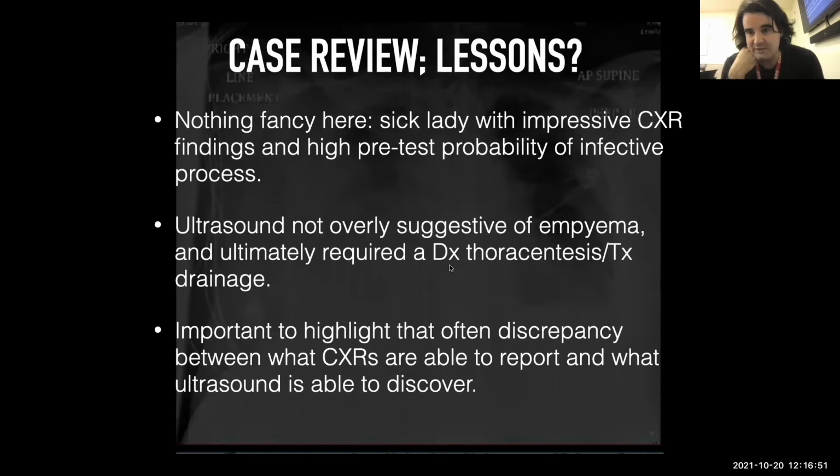But I think I just wanted to highlight a couple of things here: that ultrasounds don't always show you that a pleural effusion would be exudative, okay? And they can be pretty black and simple appearing on ultrasound and CT, okay? But still be infected. And I think that's often a misconception, that if it appears normal on ultrasound or a CT, then it's not infected, but that's actually not correct. Of course, the actual pretest probability is probably far more important than what you'll find on any kind of imaging.